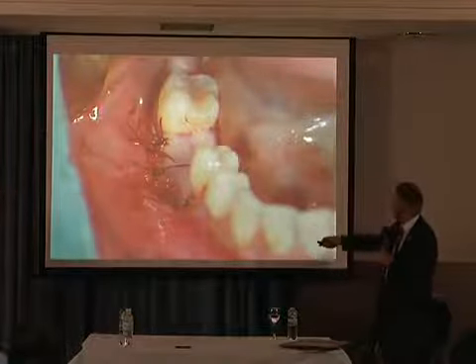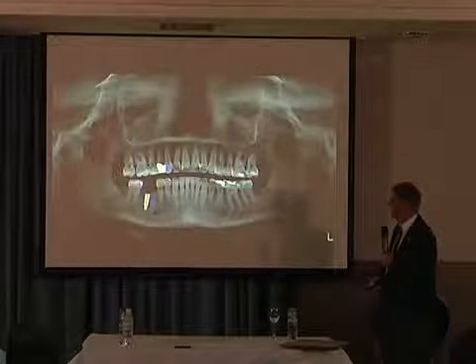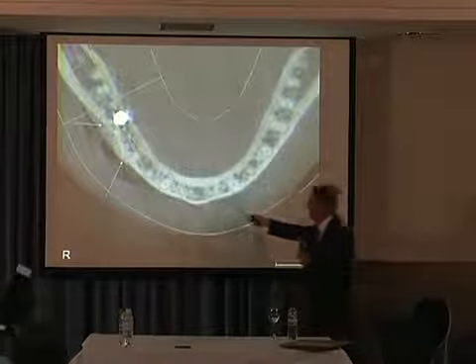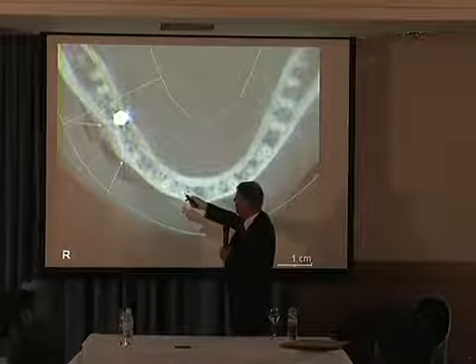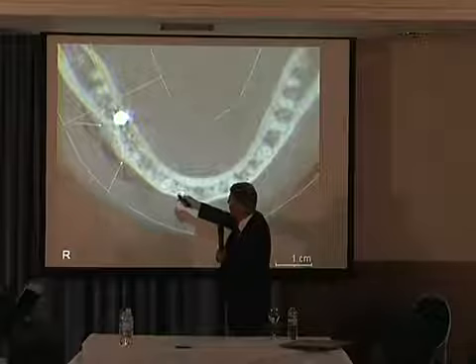New alveolar ridge. On the 3D implant, on the lingual plate, bone splitting. This is biomaterial with PRGF.